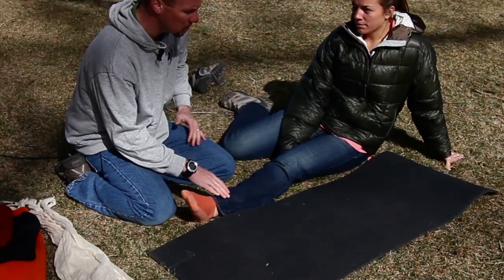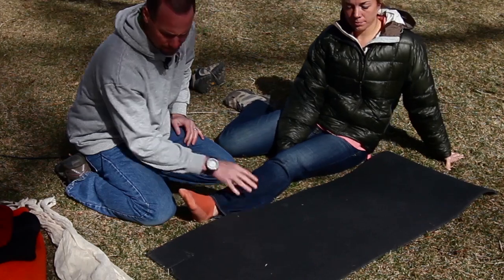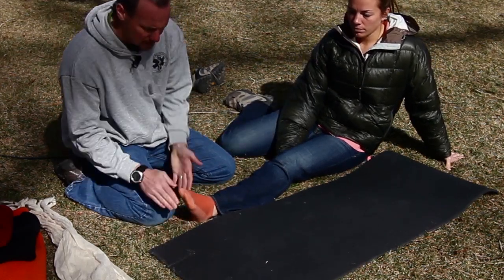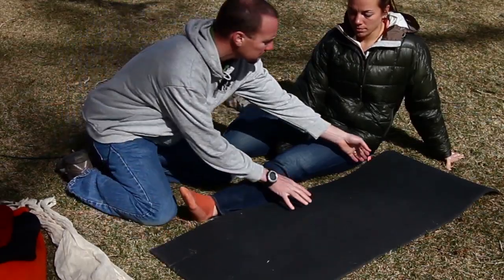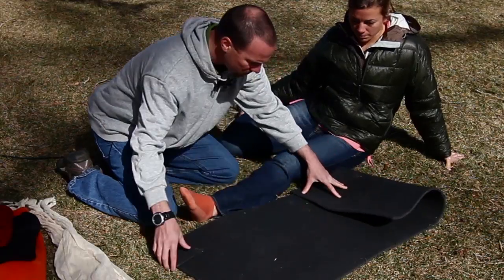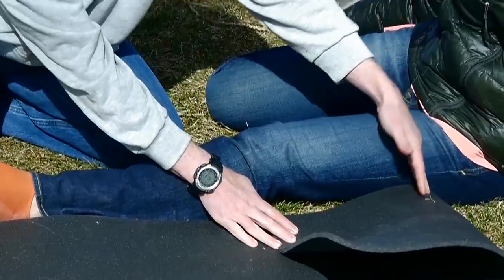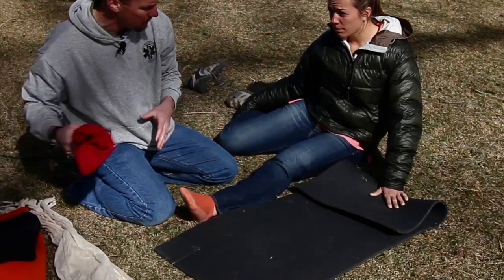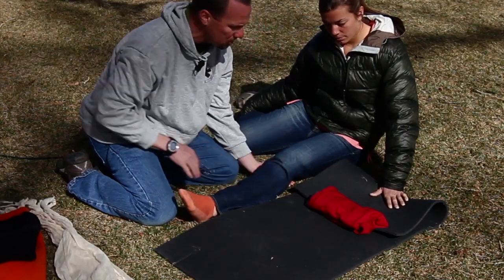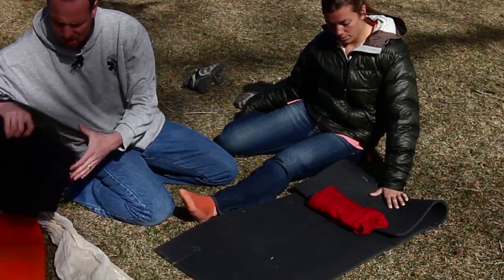We've done all of our inspection and we're ready to build a splint. I've taken, in this case, an insulite pad. I've measured it out so that it extends about the same length as Jordan's foot past her heel. I'm going to fold the top part over so that it's just as long as her leg coming up towards the top of her femur.